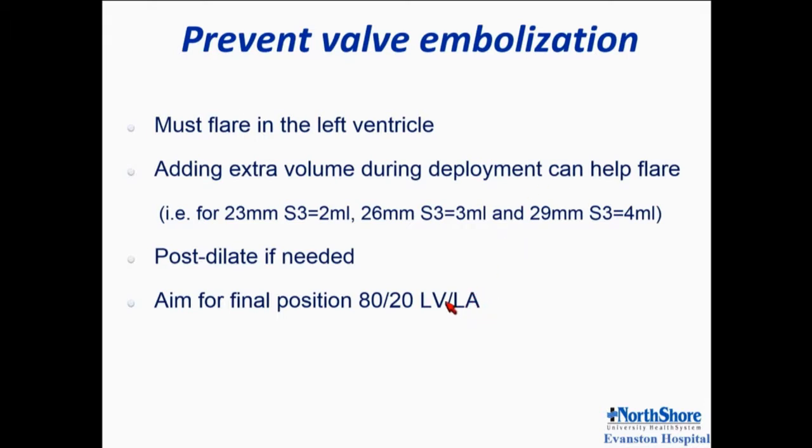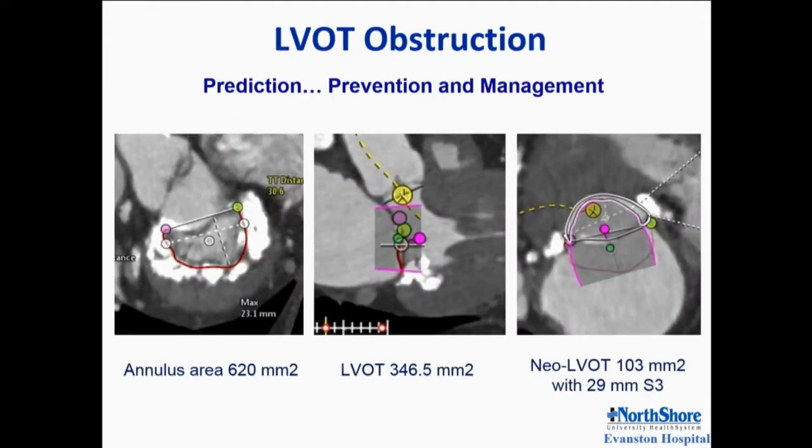Aim for a final position 80% in the left ventricle, because these valves are going to embolize to the left atrium, so it's better to stay more in the left ventricle to allow for that movement.